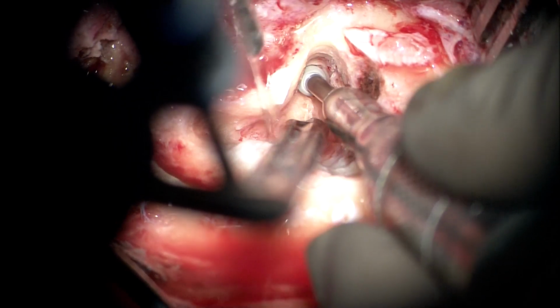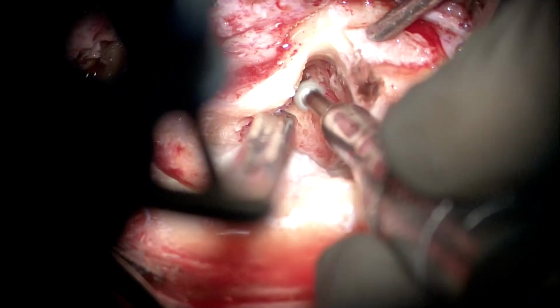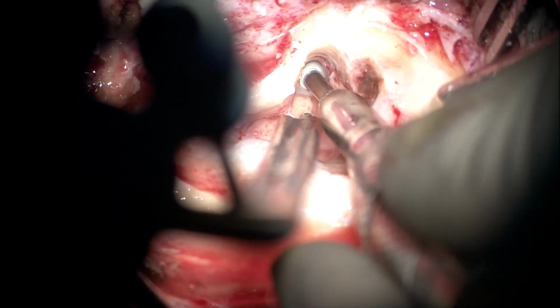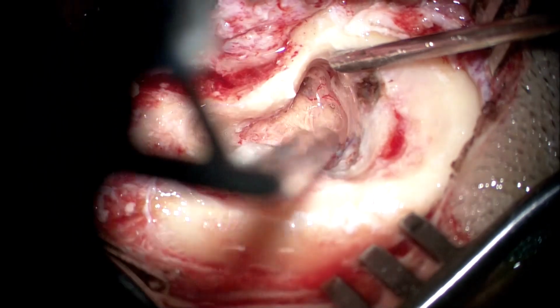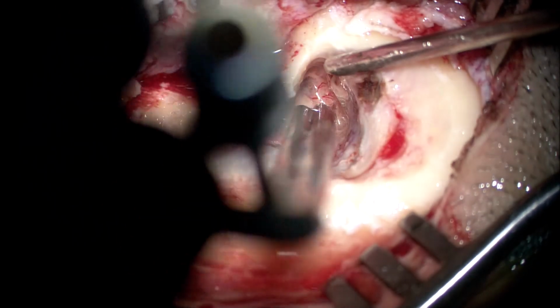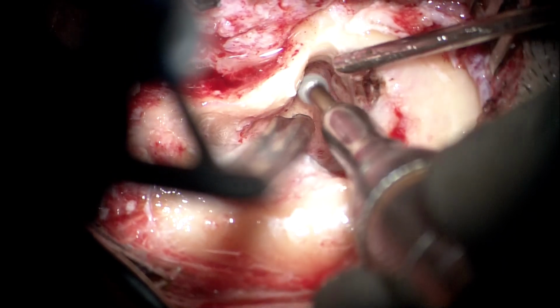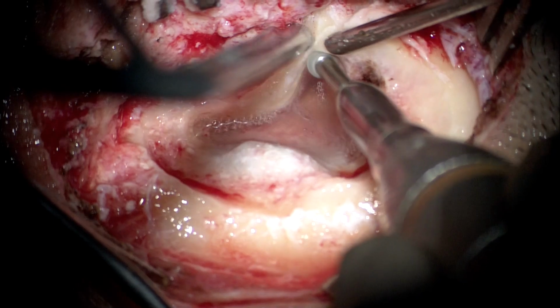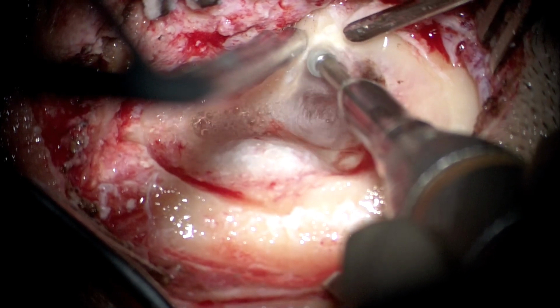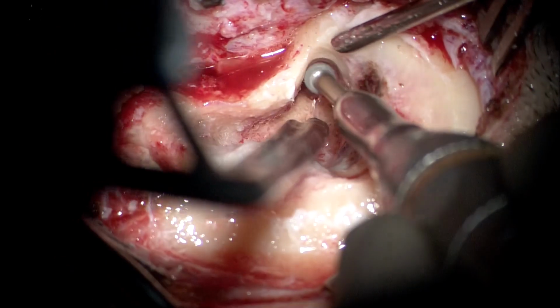So anteriorly we're going to just expose and get a visualization of the short process of incus. We do not have to strictly expose the epitympanum, but just for some additional light to get into our surgical field and to be able to see the lateral canal ampulla, one must turn slightly anteriorly to expose the posterior most part of the epitympanum, and one can stop where you start seeing the shadow of the short process of incus.